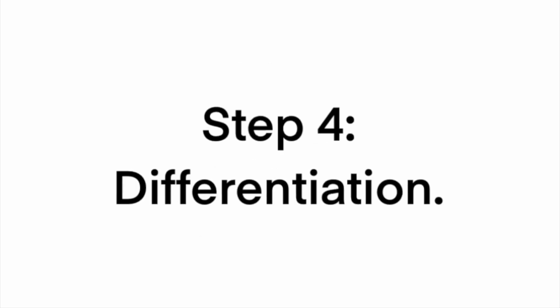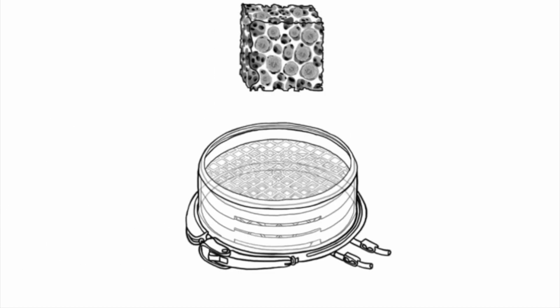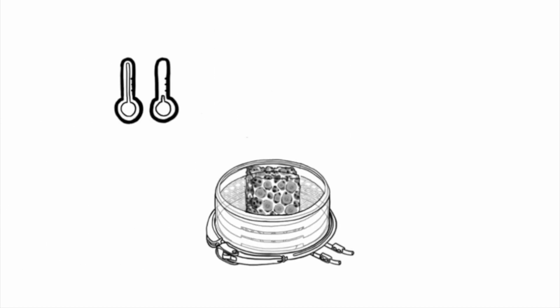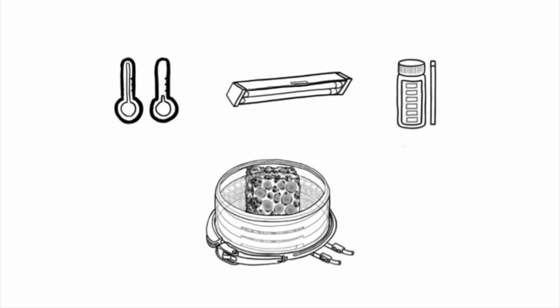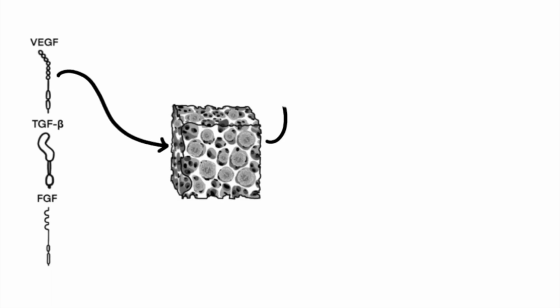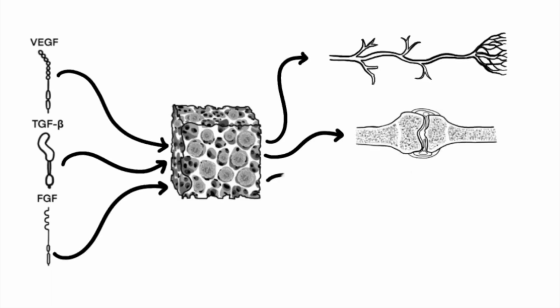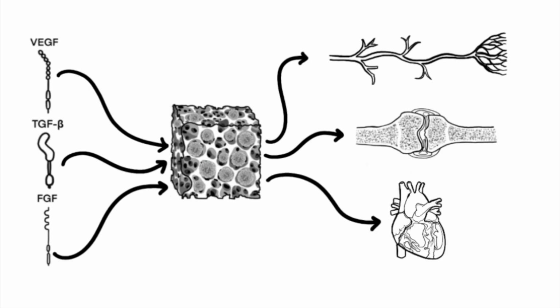Step 4. Differentiation. Altering the environment under which the stem cells undergo differentiation will determine the tissue type. Factors like temperature, UV, and pH are all used to create the desired tissue. Different growth factors can also be introduced, including vascular endothelial growth factor, transforming growth factor beta, and fibroblast growth factor, which will also alter the morphology of the final tissue.